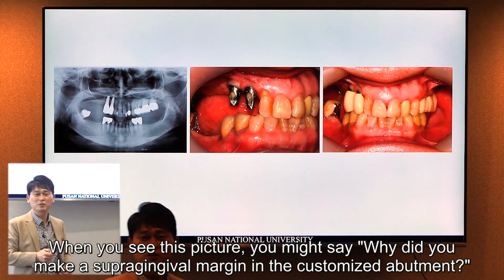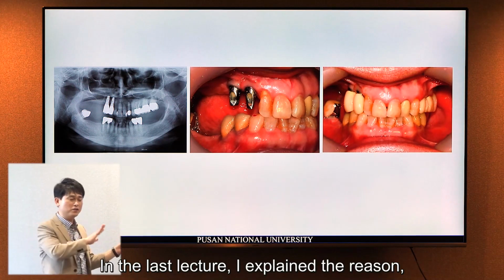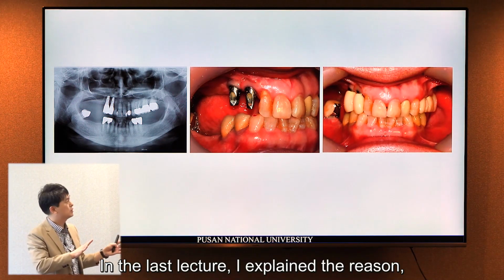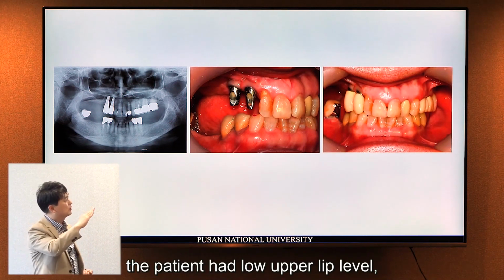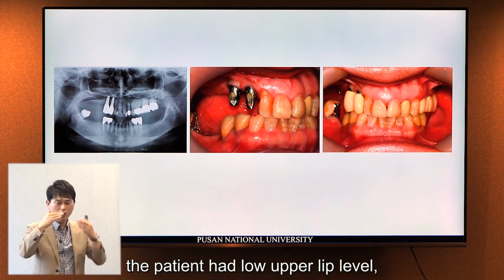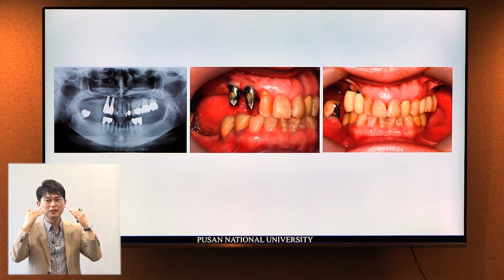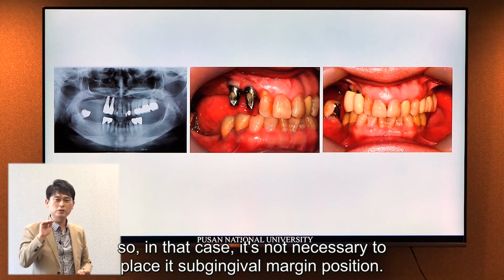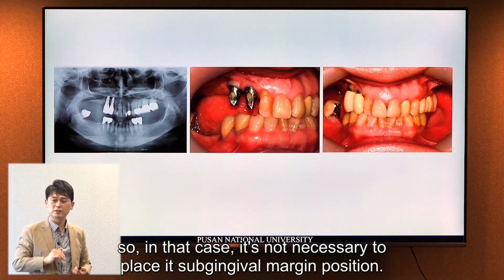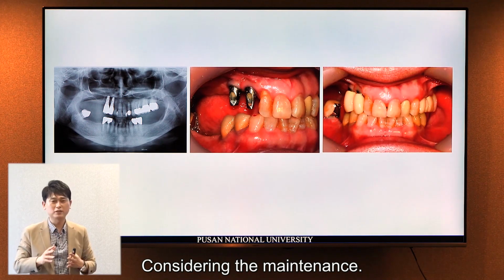You may say when you see this picture: why did you make the supragingival margin in the customized abutment? In the last lecture, I explained the reason. Anyway, the patient has a low level of the upper lip, no? So in that case, it's not necessary to position a subgingival margin for considering aesthetics, maintenance, right?